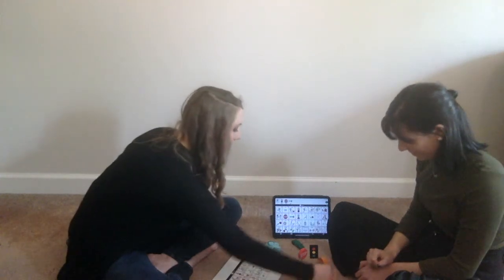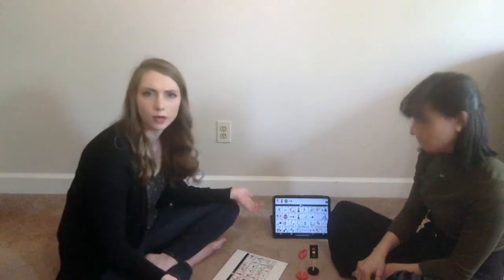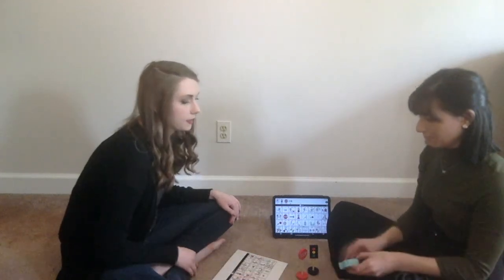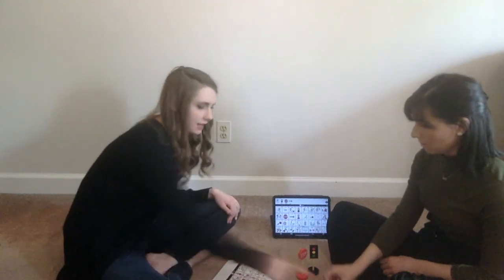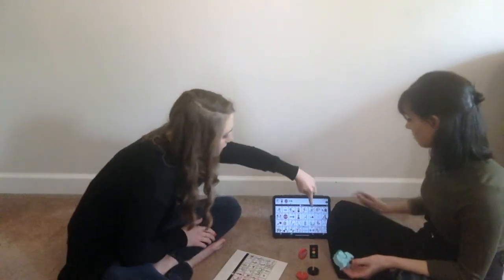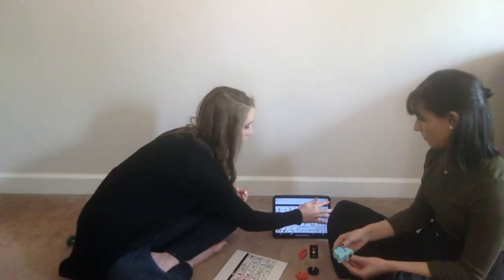Good job. Another way you can practice is by having them ask questions about what you're doing. So if Alyssa is playing with some of these toys, I might ask her, what is it? And if she doesn't know, I will help her find it on the device. So you can pick one of the animals to play with. So Alyssa chose the elephant to play with. I'm going to say, Alyssa, look. What is it? We're saying what? What is it? We don't know the answer.